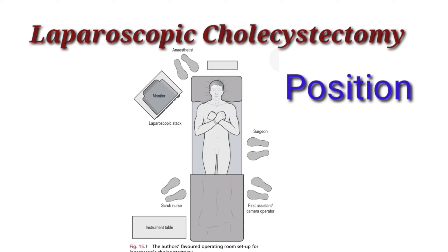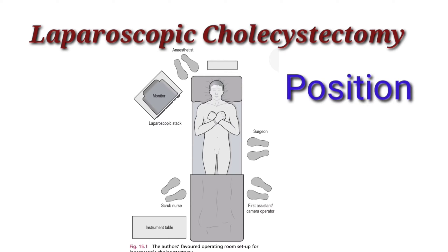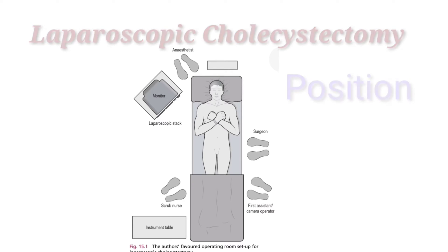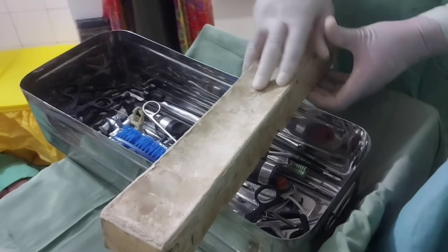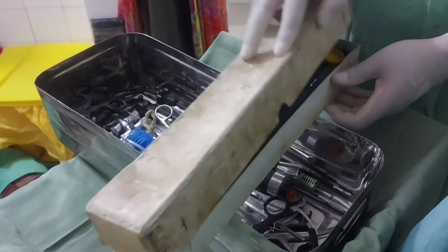During this procedure, surgeon should be on the left side of the patient. Assistant should be to the left of the surgeon, while scrub nurse and instruments are on the right side of the patient. The monitor is on patient's right shoulder at the level of surgeon's eyes.